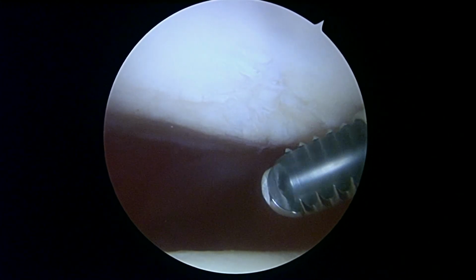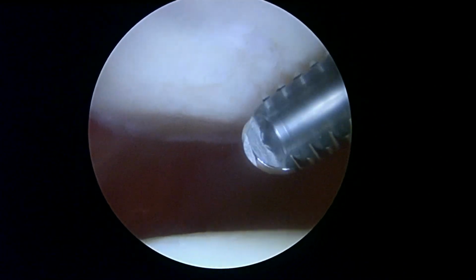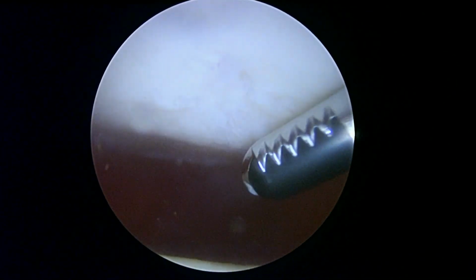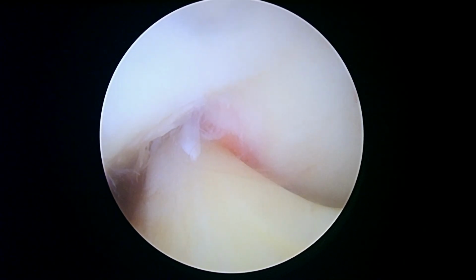Okay, so now we're looking at the patella at the top of the screen. And a little bit of chondrosis here, not too bad. There's nothing really loose. I'm touching it with the shaver, and it feels pretty stable, but you can certainly see where it's not as smooth anymore. The trochlea down below still looks like it's in pretty good shape. We can track it all the way down the front of the knee there, all the way down to where the ACL goes back in the notch. So the trochlear cartilage looks pretty good. So I think we're done with this part.